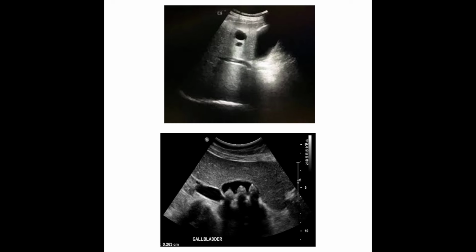So these two images show very nicely how certain structures, certain media within the body can really affect how the sound propagates through the tissue. So as a sonographer, you will be able to compensate for these, or maybe you decide to leave them because they add to the diagnosis. These four pictures show very nicely some of the key concepts behind attenuation, choosing the right transducer and the media in which the sound will travel through. As a sonographer, you will need to choose the correct tools, and you will need to know when to compensate and how to compensate for attenuated sound.